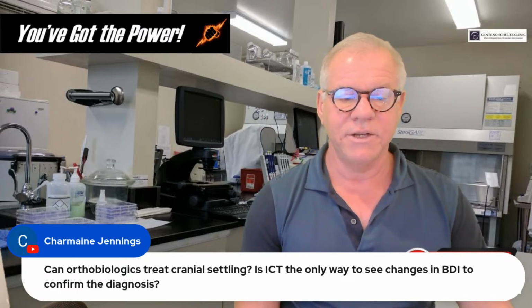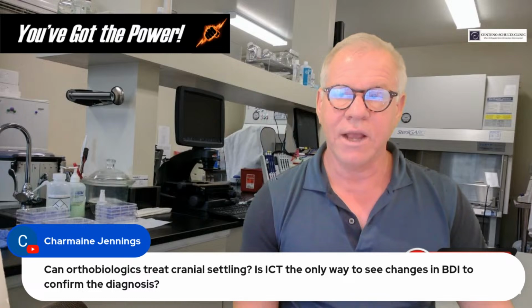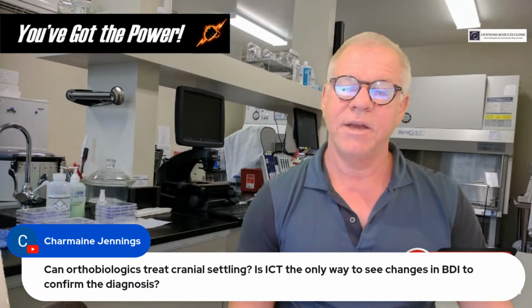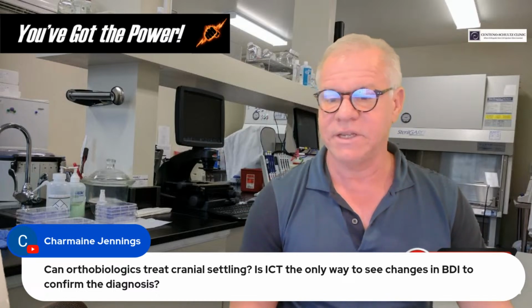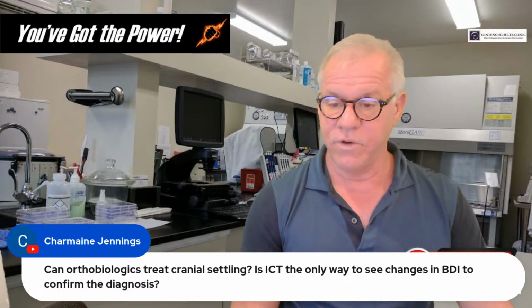Charmaine, can orthobiologics treat cranial settling? Is invasive cervical traction the only way to see changes in BDI to confirm the diagnosis? Depends on what we're talking about with cranial settling, Charmaine. If we're talking about movement or translational BDI, for example, then yes, we can reduce that movement.